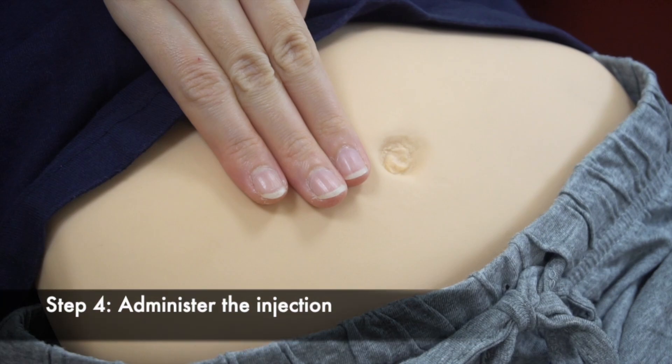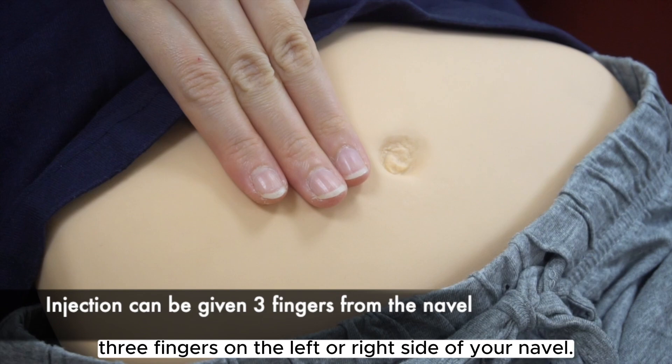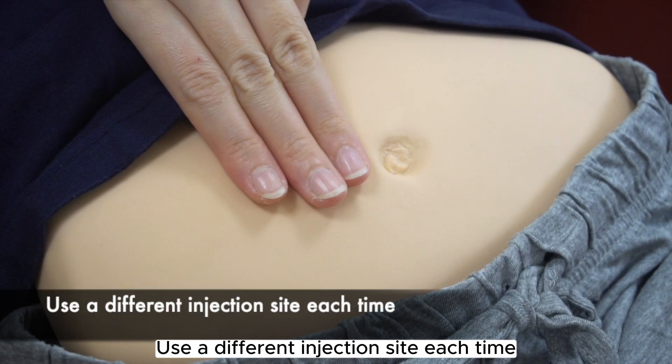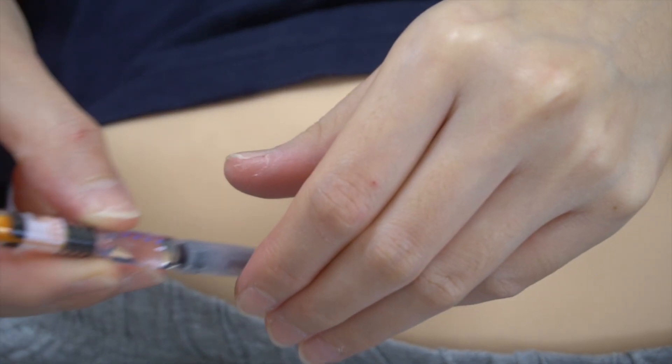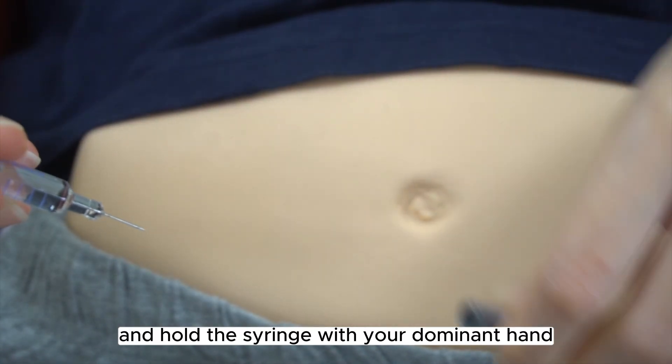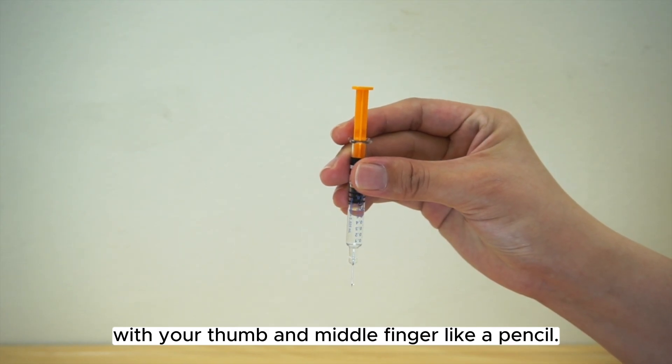Step 4. Administer the injection. The injection can be given anywhere three fingers to the left or right side of your navel. Use a different injection site each time to lessen the chance of damage to the tissue under the skin. Remove the needle cap and hold the syringe with your dominant hand, with your thumb and middle finger like a pencil.